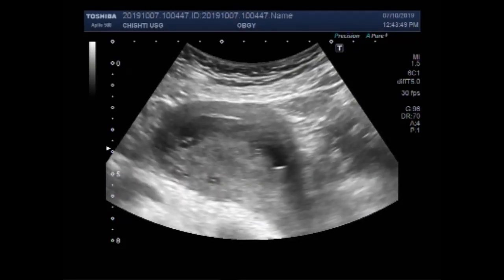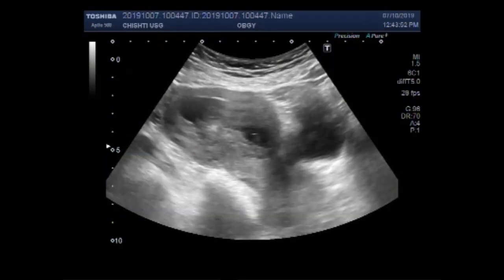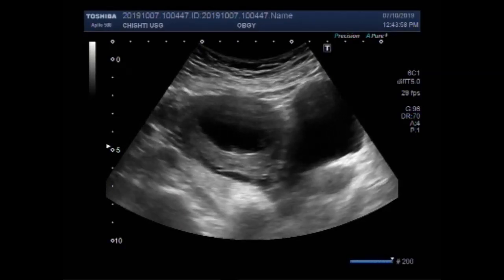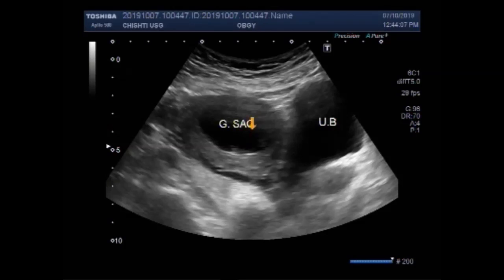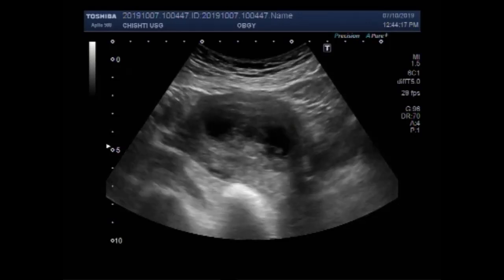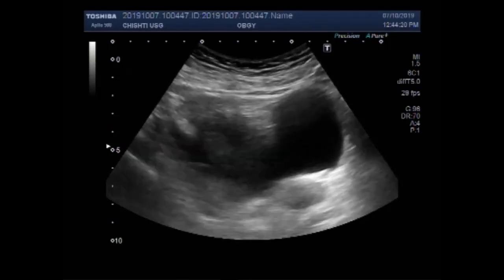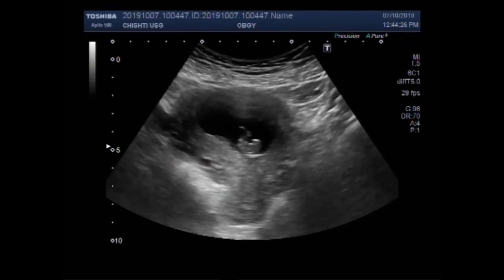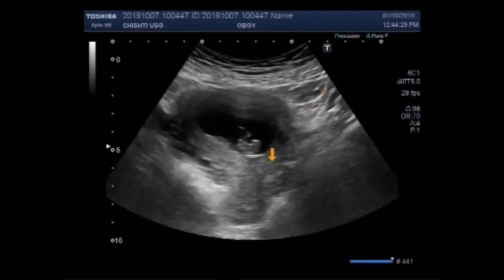You can see the urinary bladder and uterus having a gestational sac. This is the gestational sac and this is the uterus. Now you can see a small embryo visible inside the gestational sac. You can see this is the embryo.